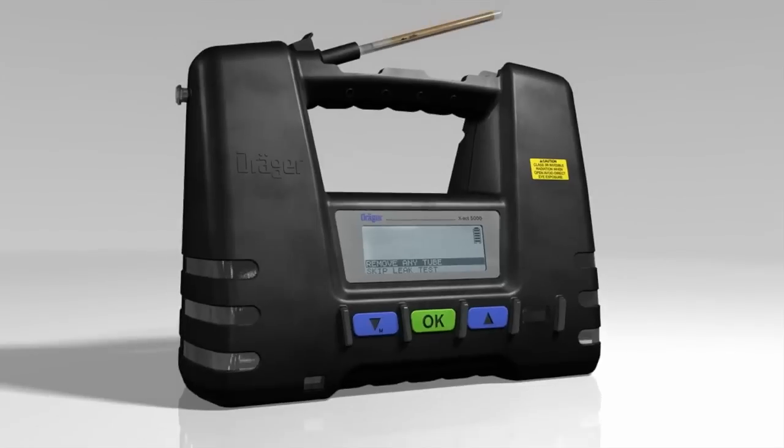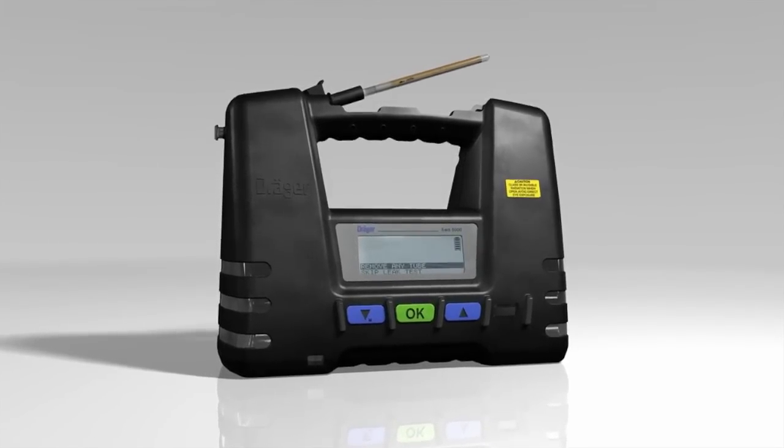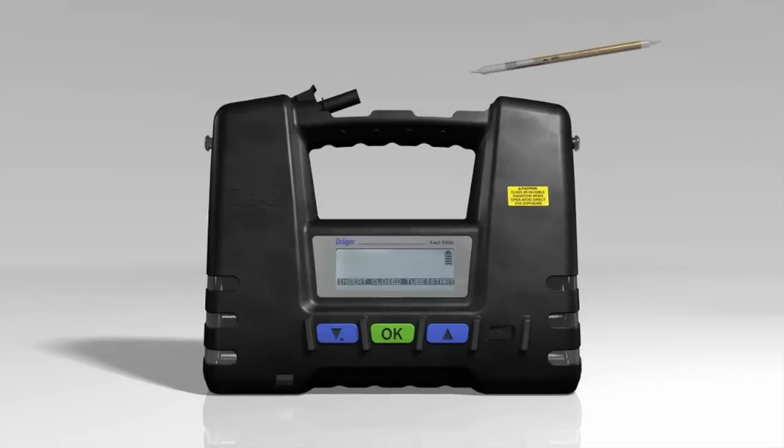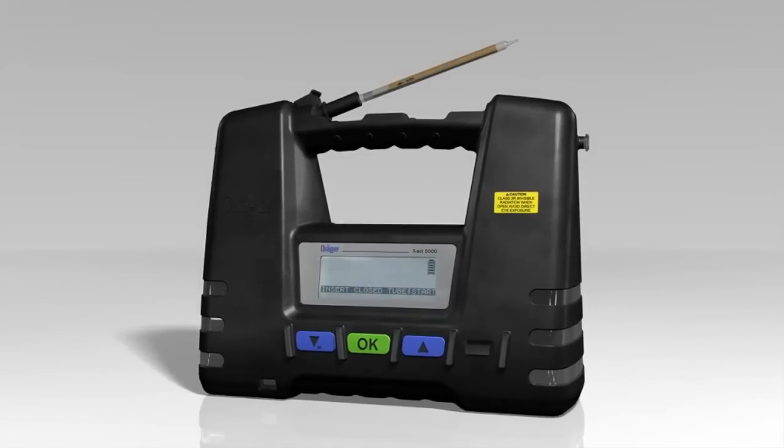To conduct a leak test, the tube pump will ask you to check whether there is a Dräger tube still in the tube holder and, if so, to remove it and then to place an unopened tube in the tube holder on top. Then press the OK button to start the leak test.